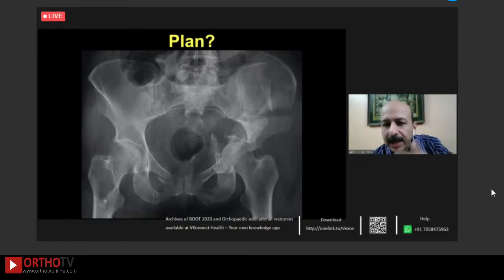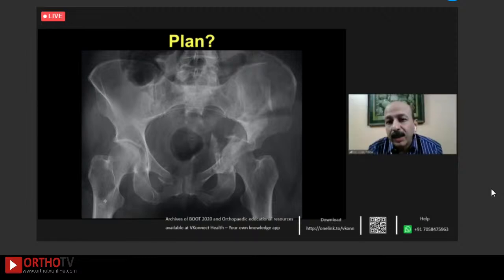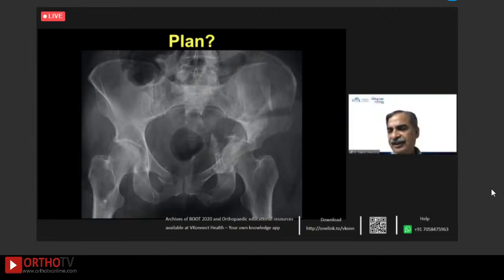Once the femoral head is back to its place, it may fall back for me, and then I just have to do an ilioinguinal or a Stoppa with a lateral window and fix it. So the posterior column will be tackled later. I wouldn't have done it as Hassan said, but because it's a column with segmental, I might not put in screws from the front. I might have to go from the back. There is likely to be significant head damage as well. I mean, Paul can tell.